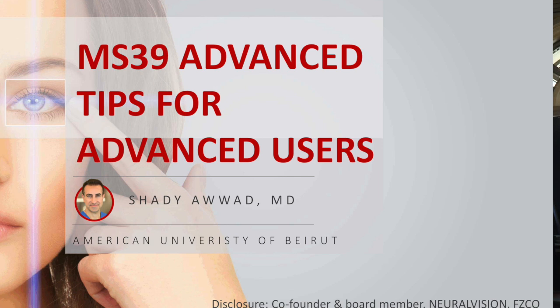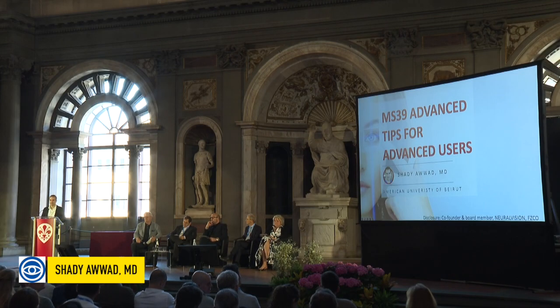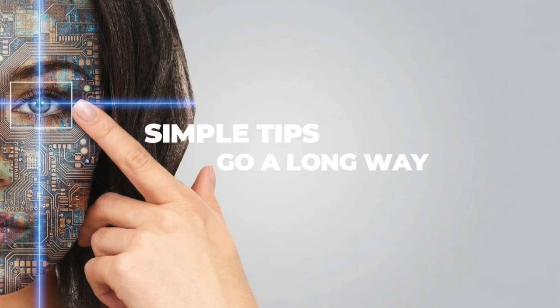MS39 tips for advanced users. We thought with Francesco to do that, to follow the basics laid down by Mazen. And I think these are not comprehensive tips. There are millions of tips probably. And nobody of us can be considered an advanced user. This is something that we keep learning, and this field keeps evolving. But I thought I would share some vital tips that helped me a lot all along.